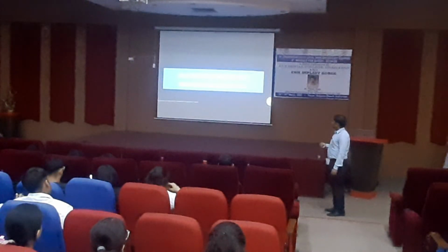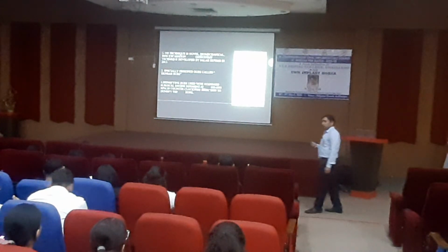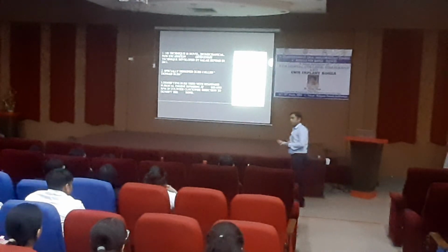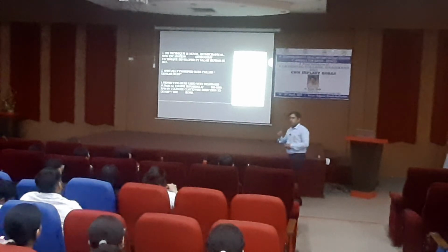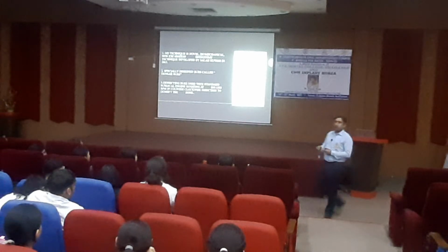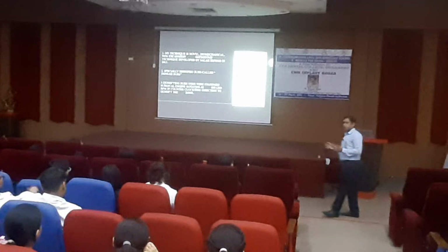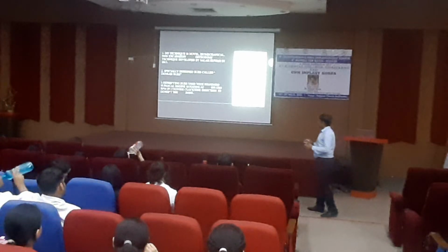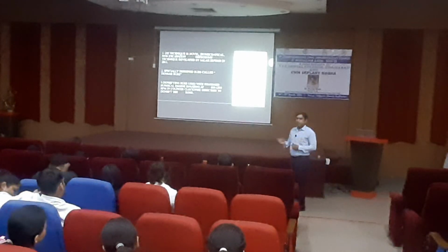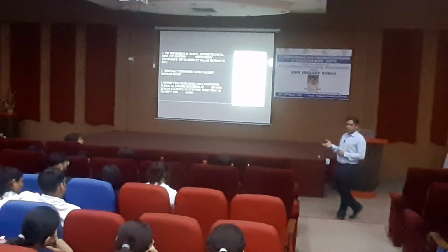Second is implant placement using osteodensification. We discussed this yesterday. So we can use the densah bur in both ways. If we are using it in a clockwise direction, it's cutting the bone. If we are using it in a reverse direction, it will prevent bone loss and cause lateralization and lateral condensation of the bone. Okay, so most of the time nowadays we are using the densah bur for osteodensification, okay?